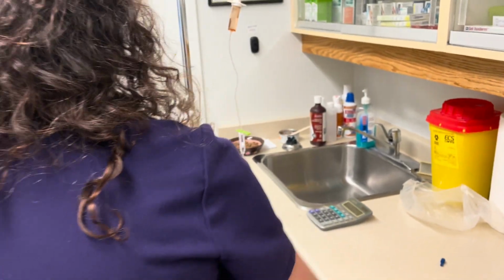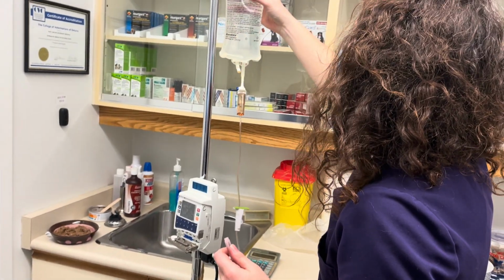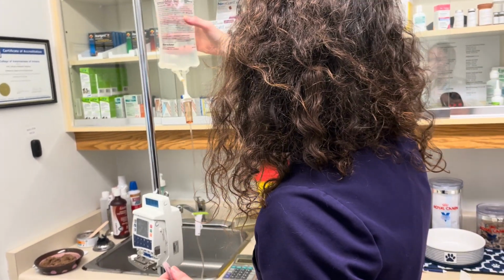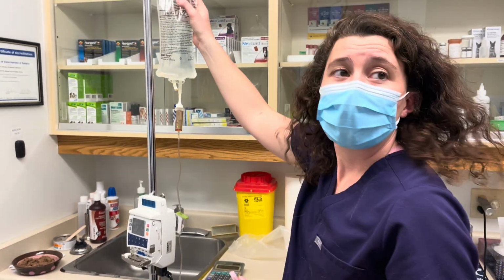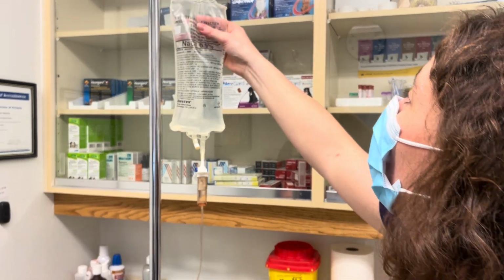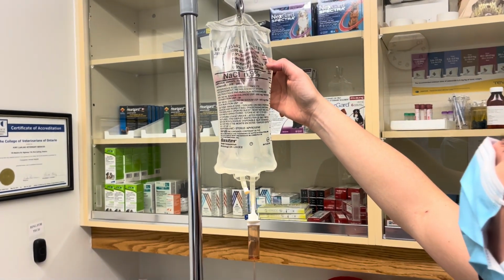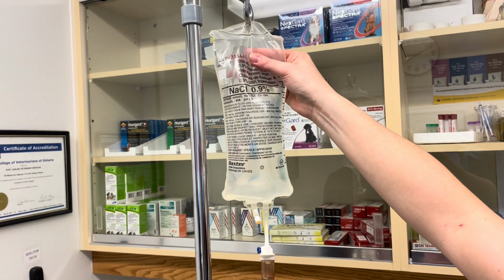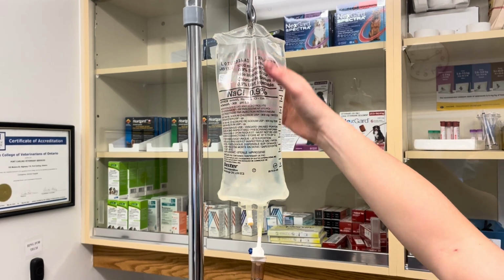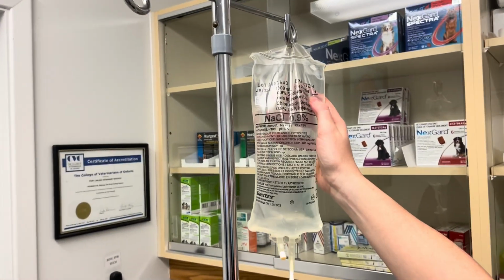So now, before we start here, we're going to take a look at our bag. The best way we can see how much fluid we have in this bag is if we look down here. We've got a 1,000 ml bag. So this is 100 mils, 200 mils, 300. We want to make sure that when we're done with the fluids we're dropping to somewhere in and around this line here, because we're going to be giving 100 mils of fluid. It's probably got about 50 mils out of it so far. So we're going to be giving somewhere around here is where we'll be going.